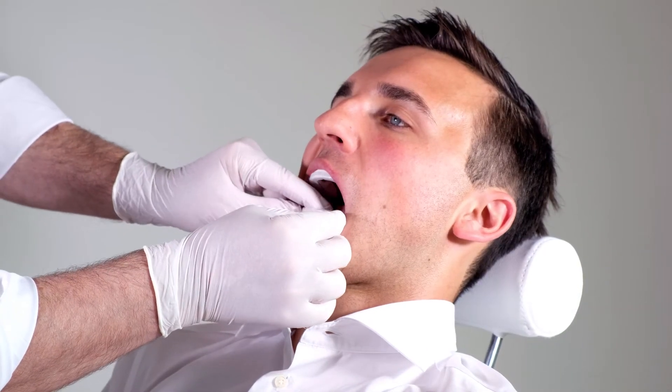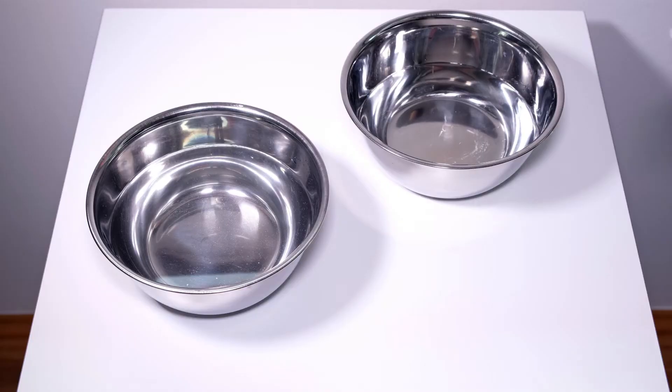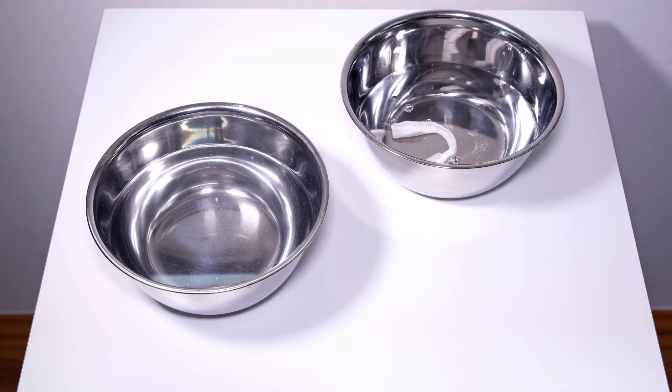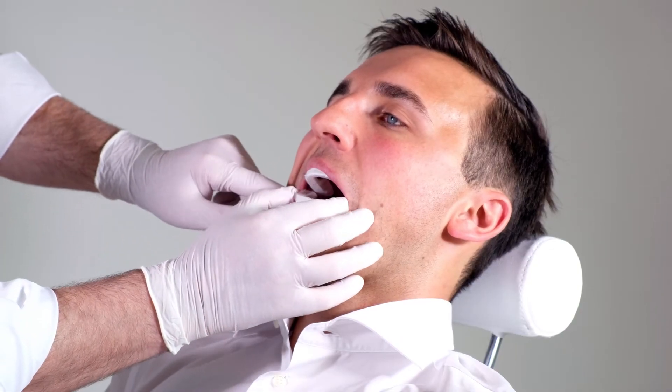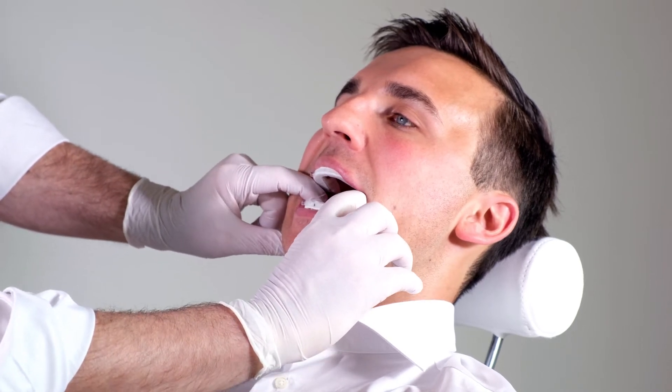Grab the fixation knobs to vertically and carefully remove the tray from the mouth. Let the tray cool down in the bowl filled with cold water for about 20 seconds to harden the material. Place the lower tray on the teeth and check its fit. If it's not perfect, the fitting process can be repeated.